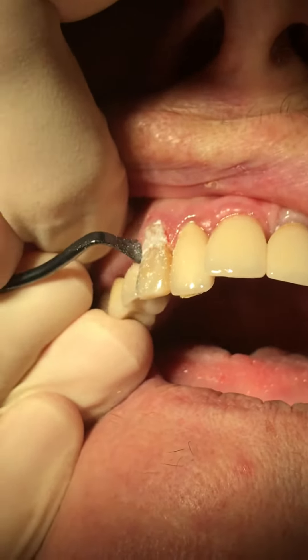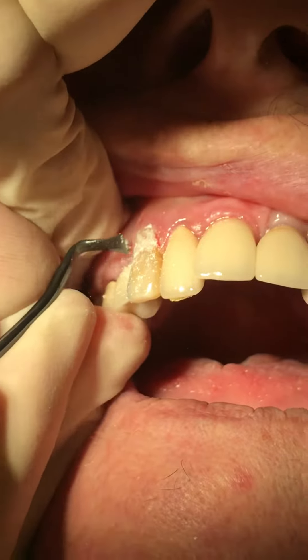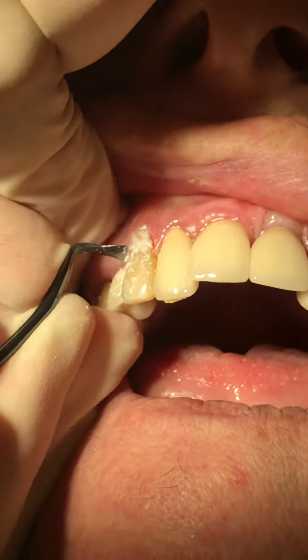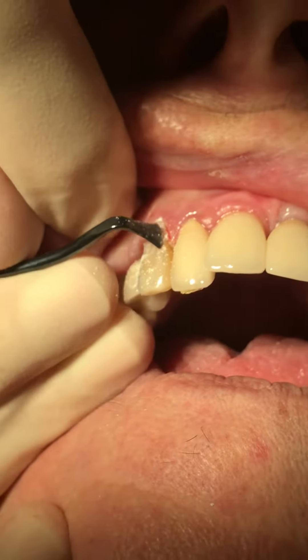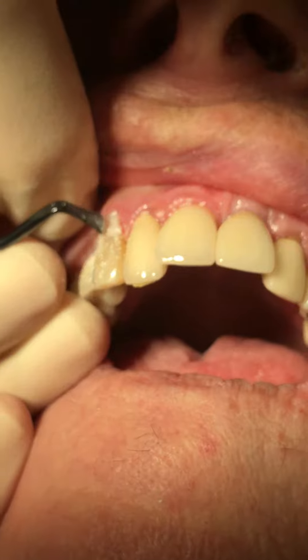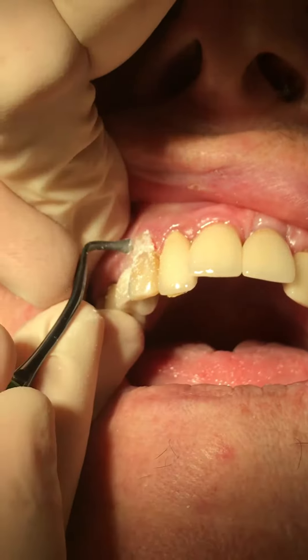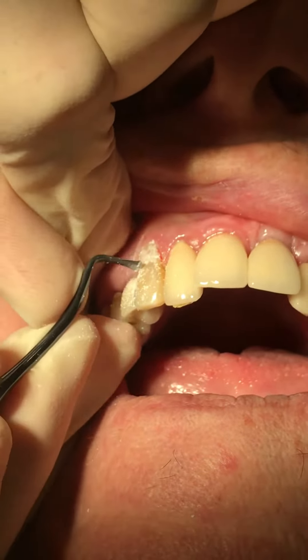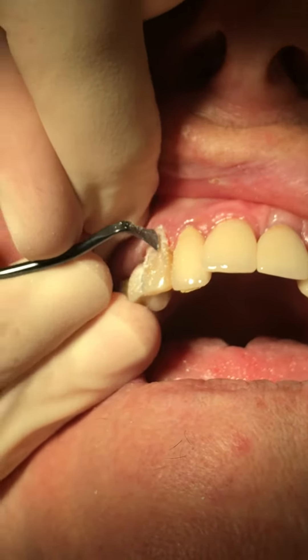With these instruments they cut extremely well, and if you're cautious you will not damage the papilla. Again, for demonstration purposes I have overbuilt this composite just to show the cutting efficiency — they cut very nicely. Under regular circumstances I would probably trim most of this with a bur, a very fine diamond.